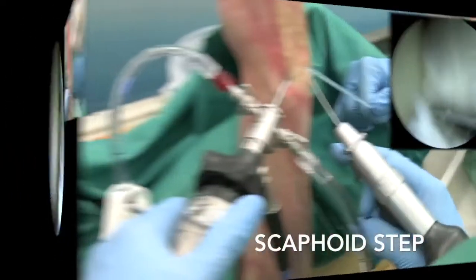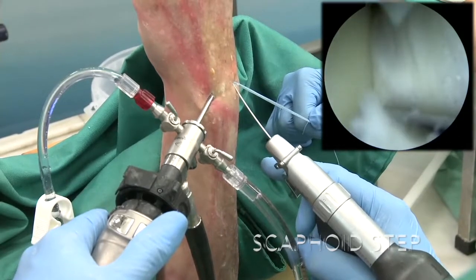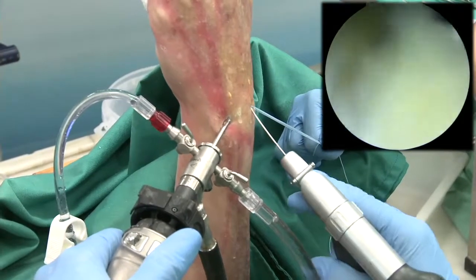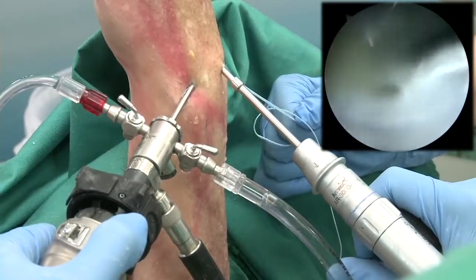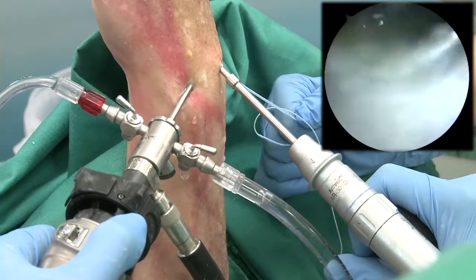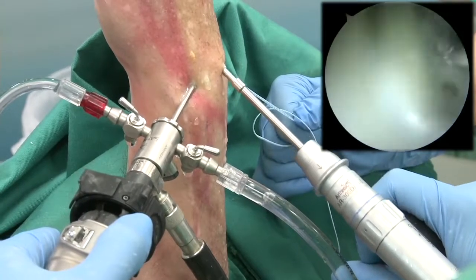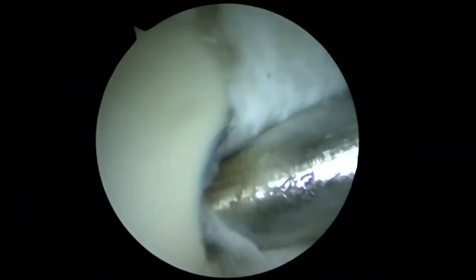With the arthroscope inserted through the 4-5 portal, the fiber tape is retrieved from the 3-4 portal. From the 3-4 portal, we introduce a 1.2mm guide wire into the proximal pole of the scaphoid under arthroscopic control.